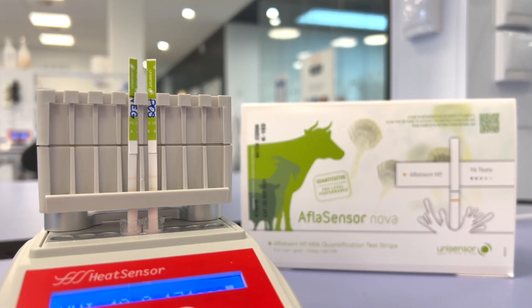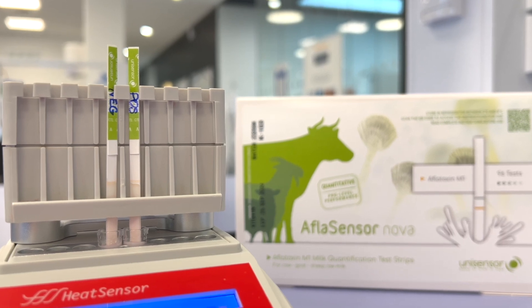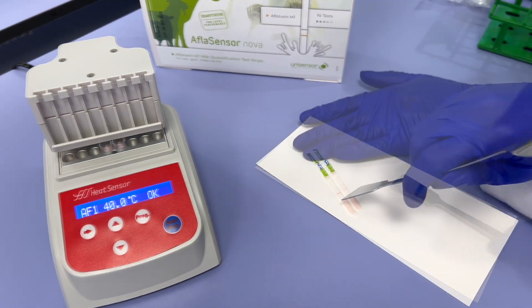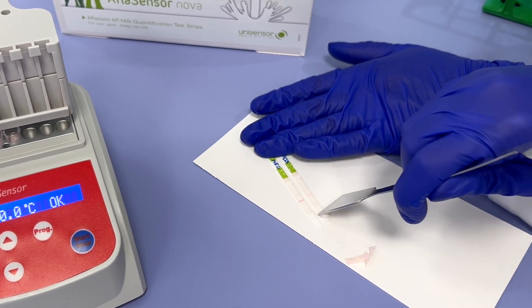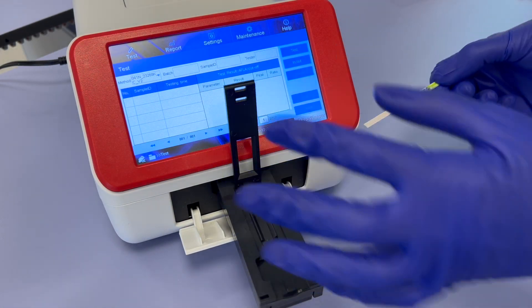After the initial incubation, the test strips will automatically be immersed into the microwells, and the migration will continue for seven additional minutes. Once the incubation with the test strips is complete, remove the test strips from the microwells and holder, and place them on a clean sheet of paper. Carefully remove the sample pads without damaging the central membrane. Proceed with the interpretation using ReadSensor 2 within one minute.